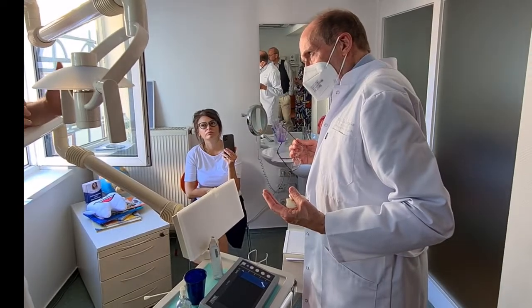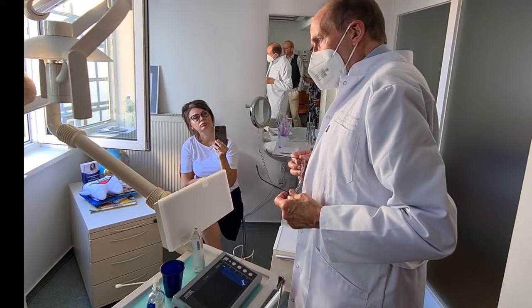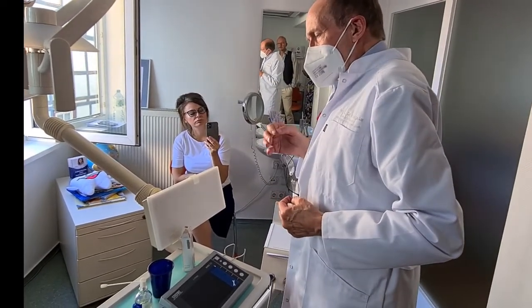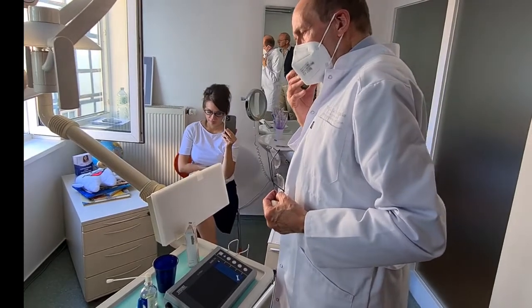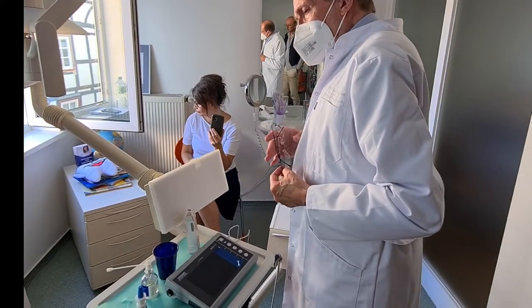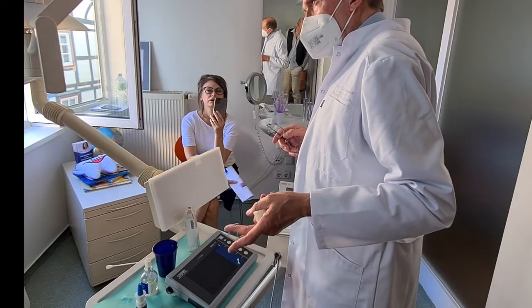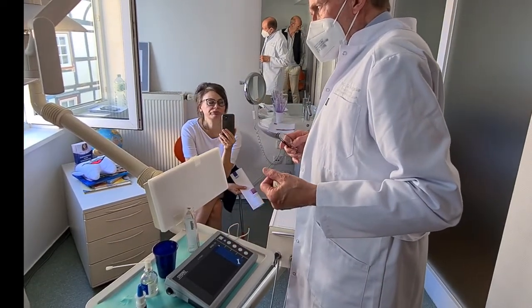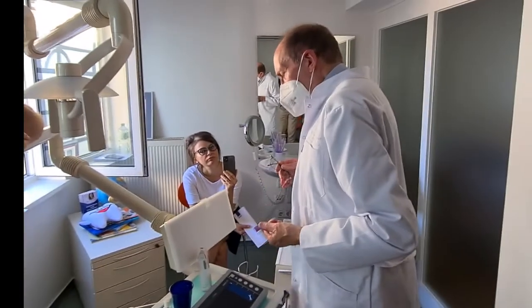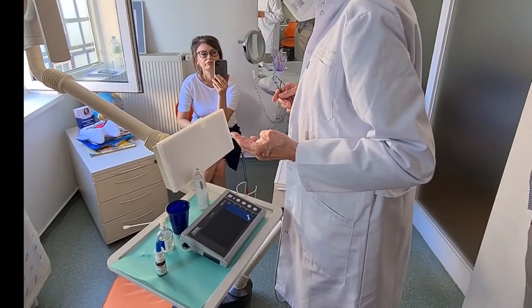So not further than this, nothing else. Because the K is closure of the third valve. And when we close the third valve, there is still some noise from the lateral wall of the pharynx. So there is an enlargement of the pharyngeal wall. This could be seen clearly. Apparently the lateral aspects of the pharyngeal wall are still able to produce some noise.